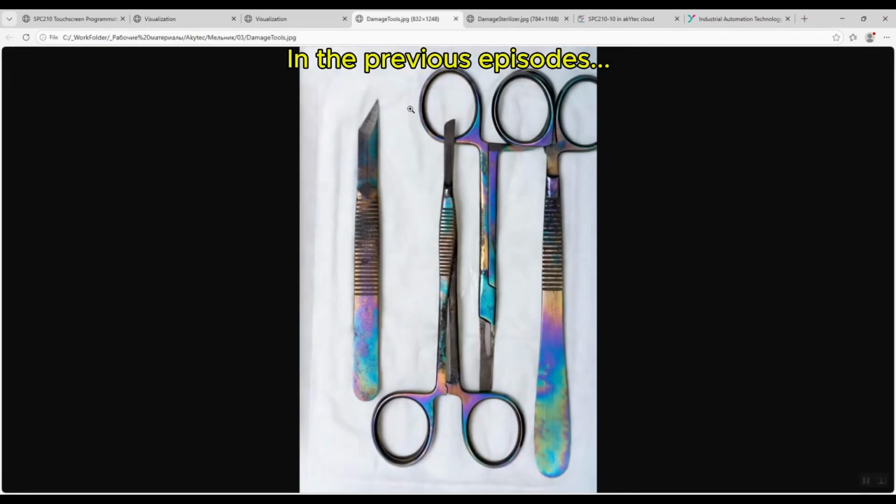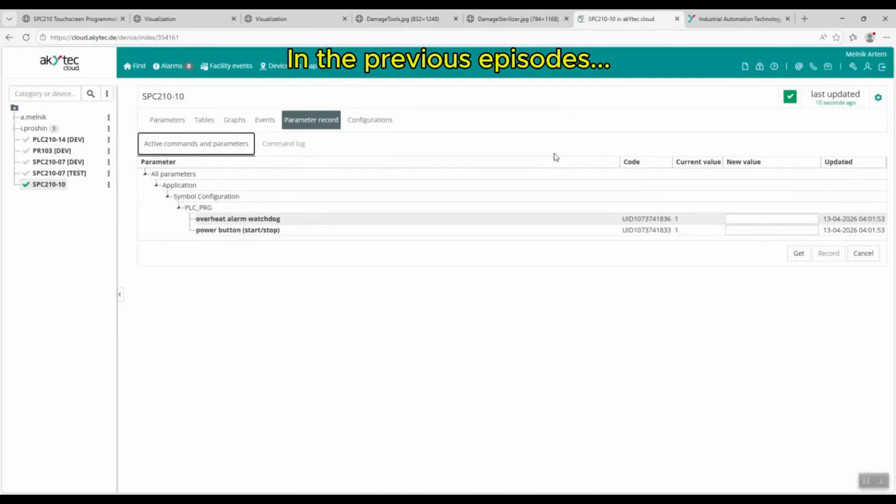With prolonged exposure to temperatures above 200 degrees Celsius, the cutting edges of metal instruments can lose their sharpness, and it can also cause the metal to lose its hardness and strength, as well as change its color. We send this alarm to the cloud service of the company akYtec in read and write mode, so that only the operator can reset this alarm after analyzing the abnormal situation and fixing the cause of the sterilizer malfunction.